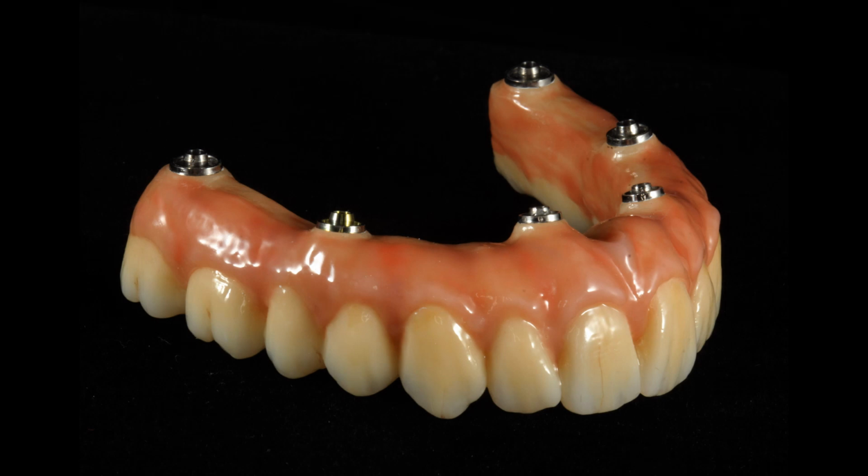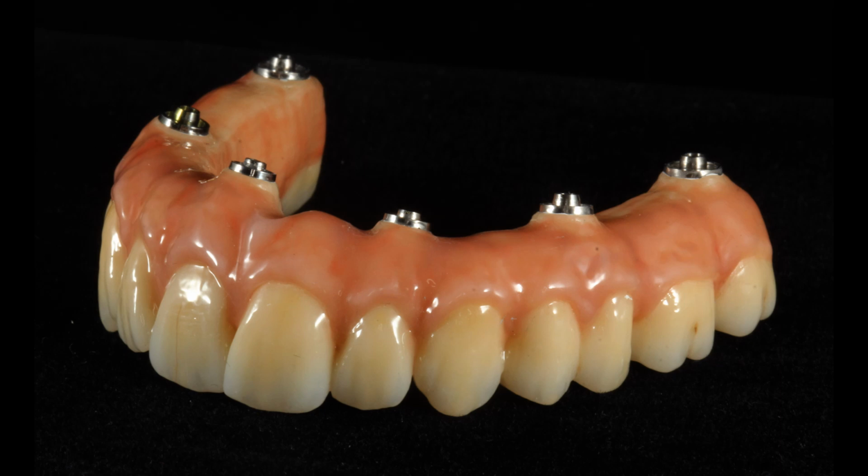This is the right view of the same prosthesis. And again, I would just point out that all of these contours are cleansable by the patient. Everything's a smooth and gentle, convex profile. The left view of the same prosthesis.